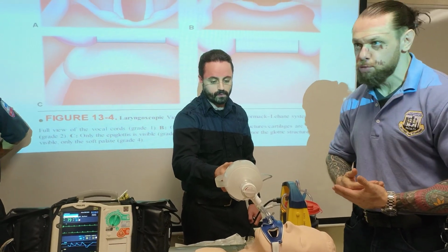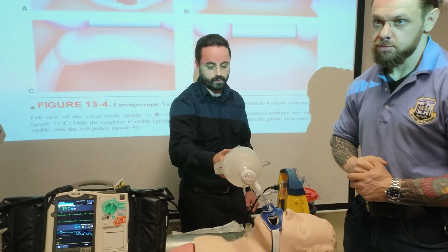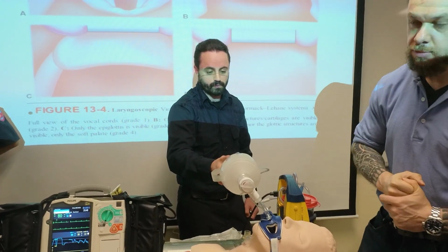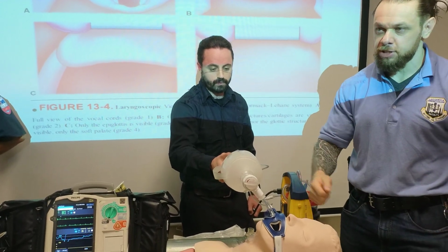It's very hard to argue the tube was not in the right place when you've got the doctor's name at the bedside and at the time of the transfer. So any type of movement, any type of thing, recheck everything.